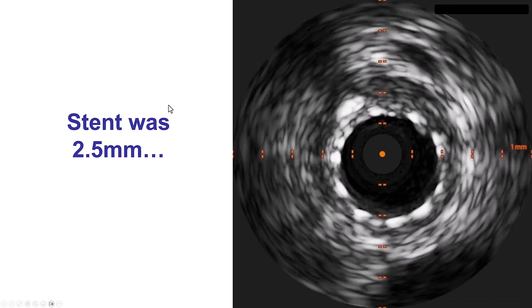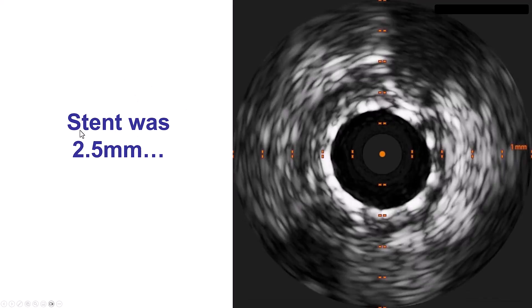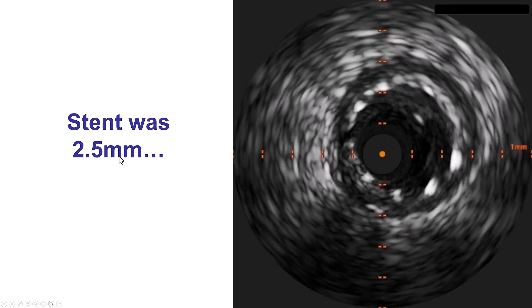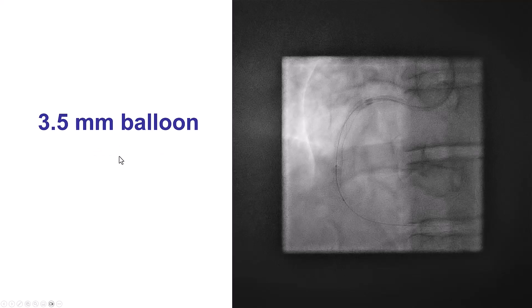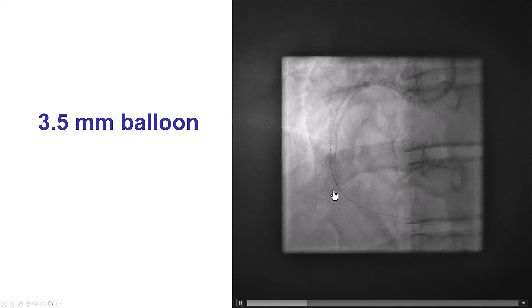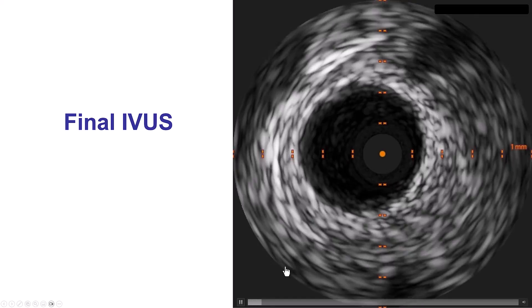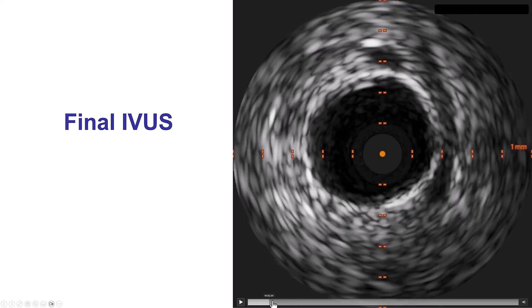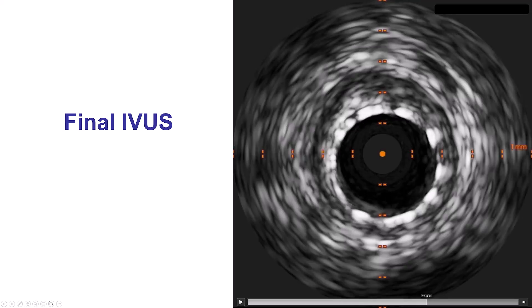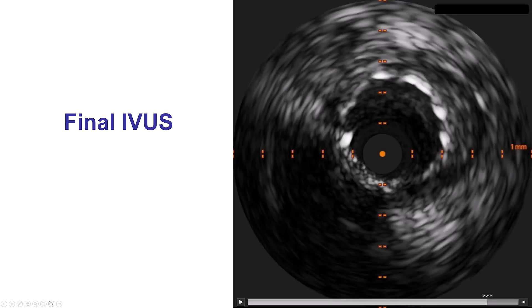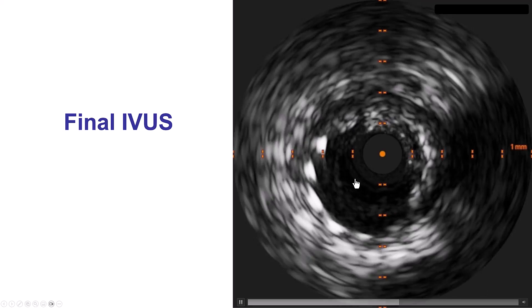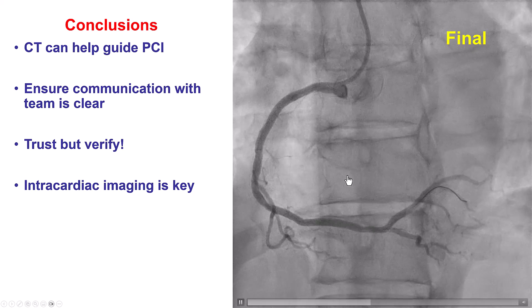So what was going on? It turned out the second stent that was placed was actually 2.5 mm, not 3.5 mm. We then used a 3.5 mm balloon to expand the stent well, and now we have good stent expansion throughout. There is no longer the inner stent streaming inside the outer stent.